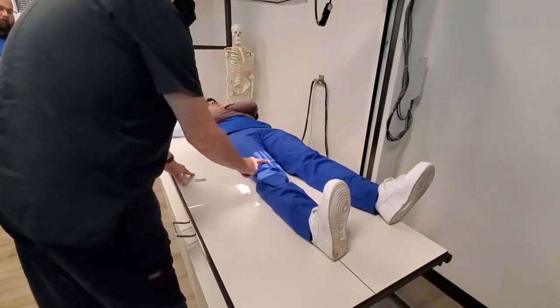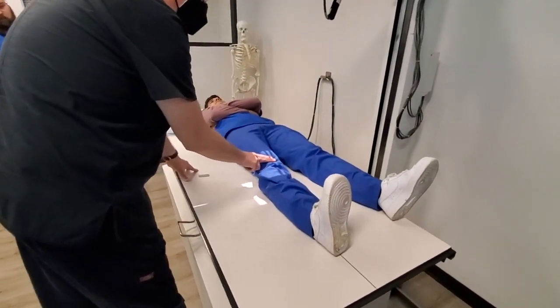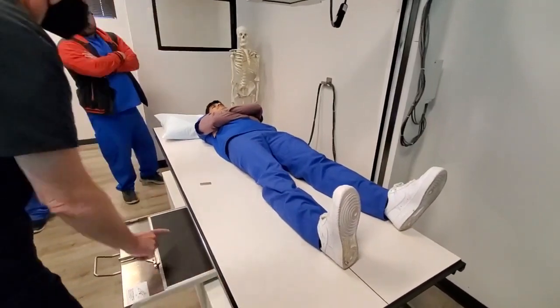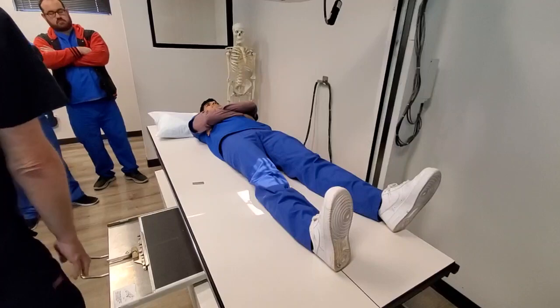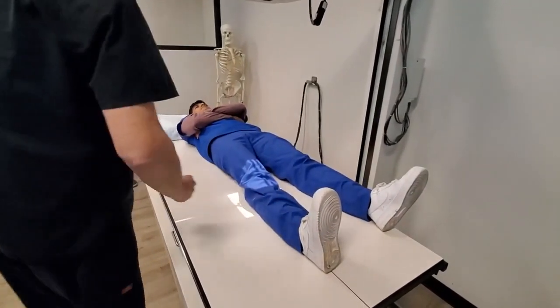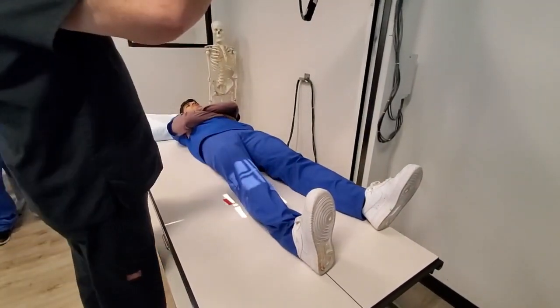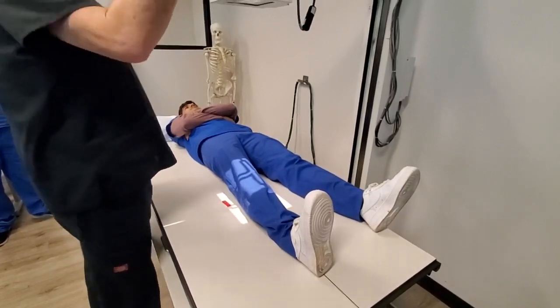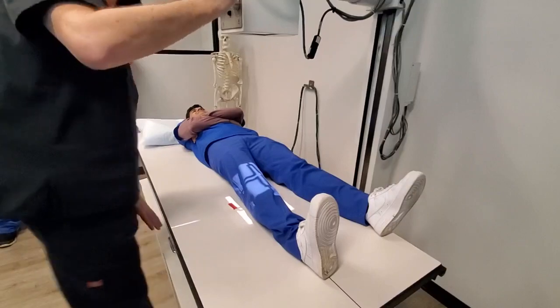We're going to find the patella. This is the apex of the patella right here — two fingers, half an inch. Be sure that your CR and your IR are lined up properly. Marker goes lateral, always. SID should be 40 inches. Not tabletop — grid. We're using the grid now.